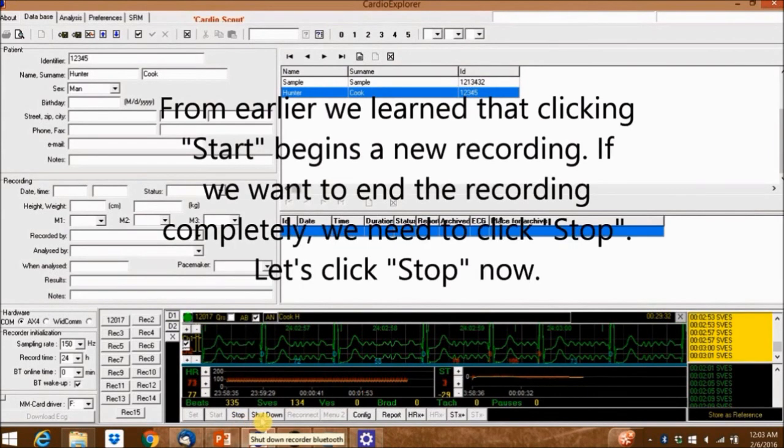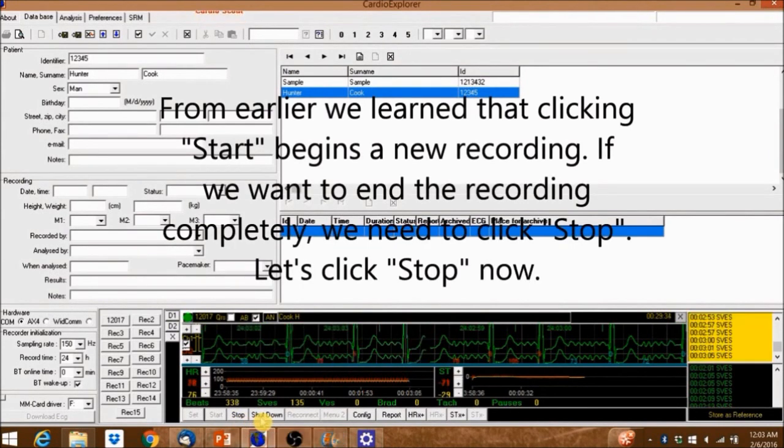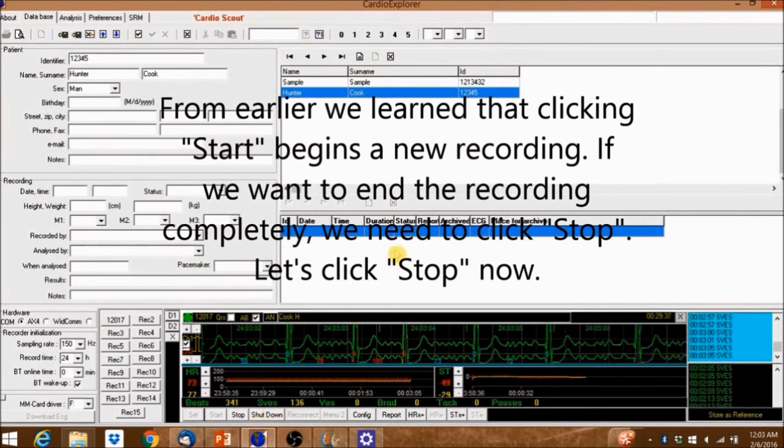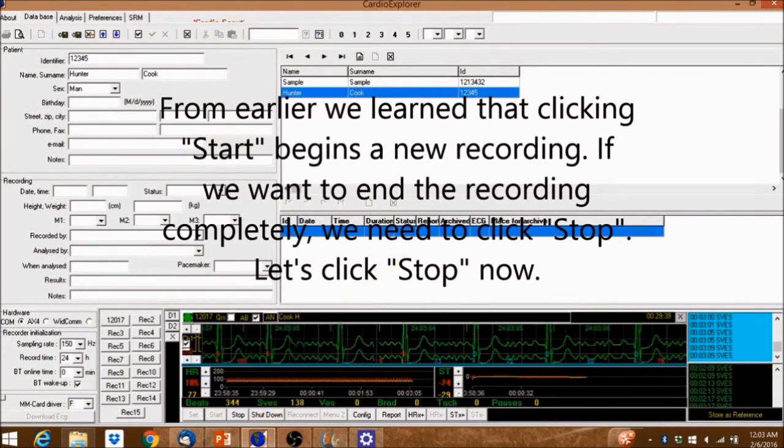From earlier we learned that clicking start begins a new recording. If we want to end the recording completely we need to click stop. Let's click stop now.